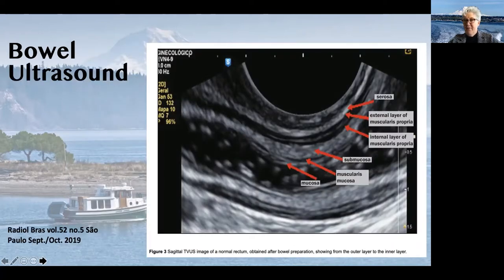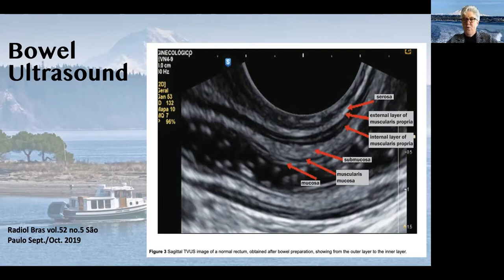I ultrasound everybody — it is part of my surgical planning. I think that it's very important in order to help with understanding of how to proceed, what types of procedure to do, and how to counsel your patients preoperatively.